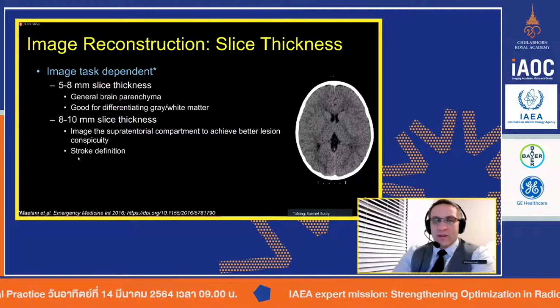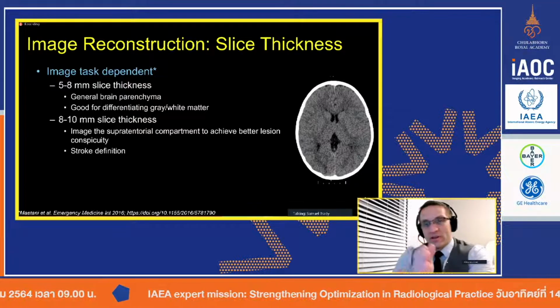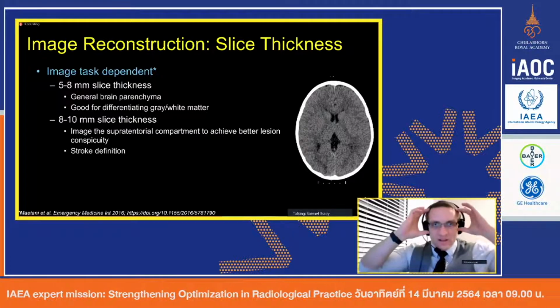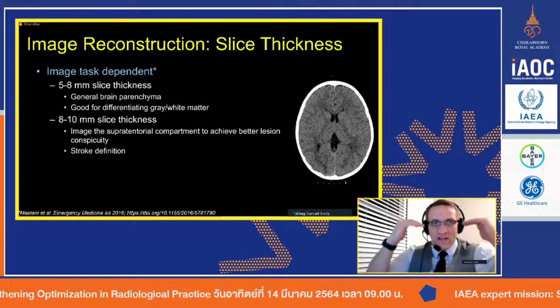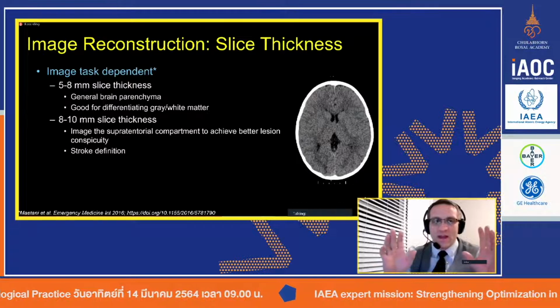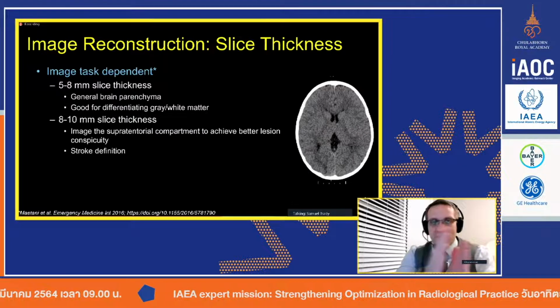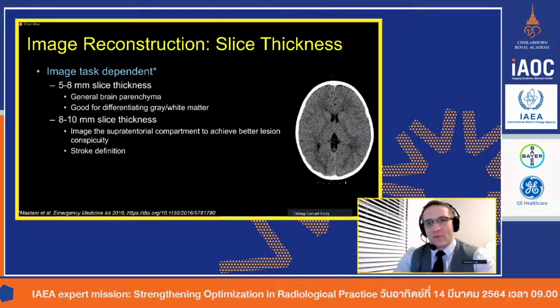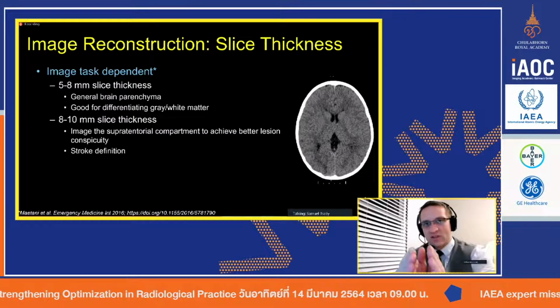So it's good if we can set these slice thicknesses up a priori. In other words, the patient comes in, they're on the table. We're going to either acquire a single axial spin, or we're going to pick one of the two helical scans, be it with fixed tube current or tube current modulation, either one. And then we have the thin data that we will add together at various different slice thicknesses. Being able to give the right image for the right clinical indication is very important.